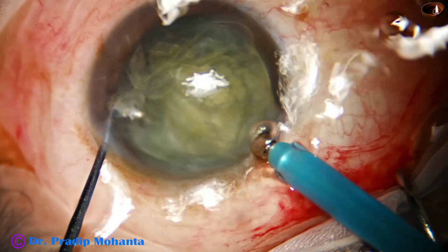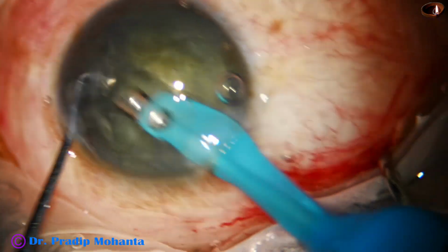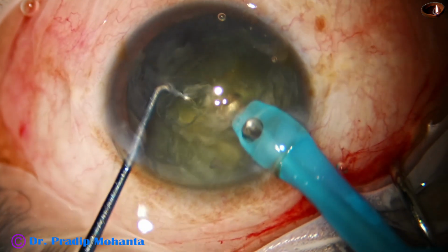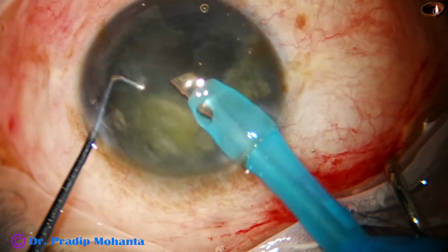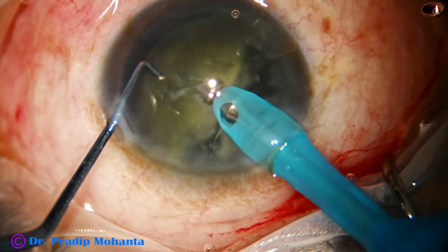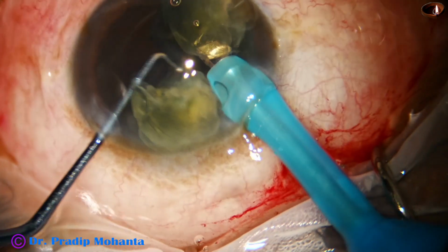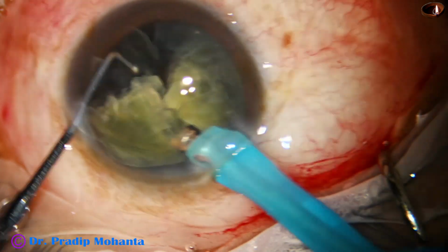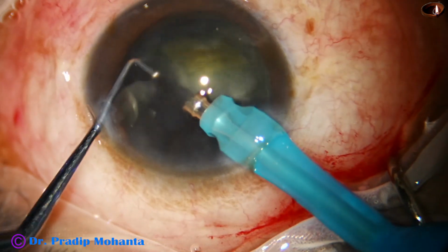It just goes, aspirates the cortex and picks up one free nuclear piece and starts emulsifying. And then this heminucleus is easily chopped by the ball-tipped nucleus sustainer, chopped or divided into two pieces, and these remaining two pieces are easily emulsified.